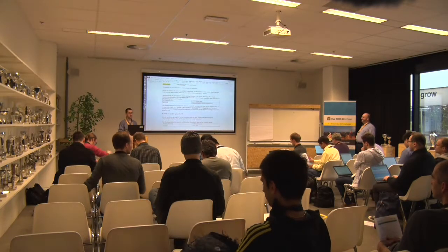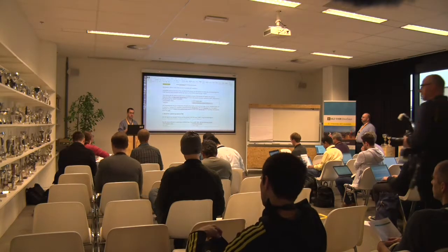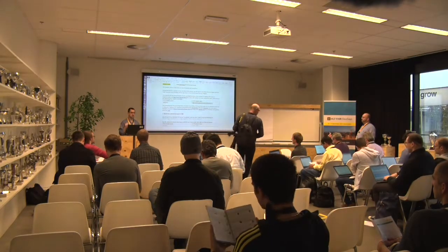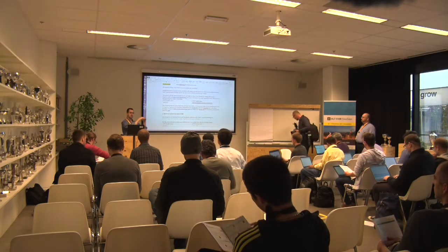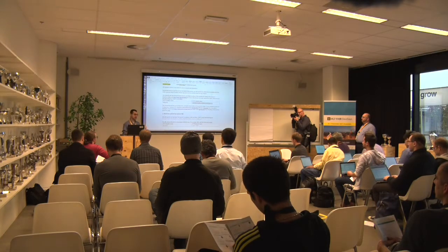The two things that don't work right now: we actually just switched the FHIR server implementation, and the new one isn't properly set up, so things are not working right. For example, the link that Brad was talking about, the address element that takes you from FHIR to DICOMweb by providing you with the actual URL for DICOMweb, isn't working on our server. But it's okay; we can still find our way around it.